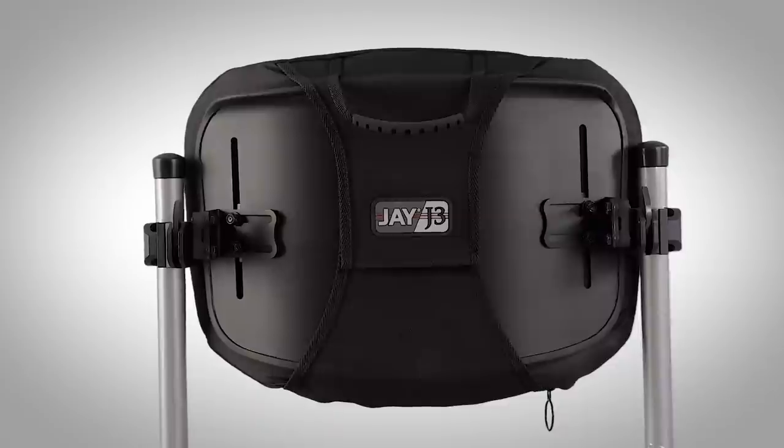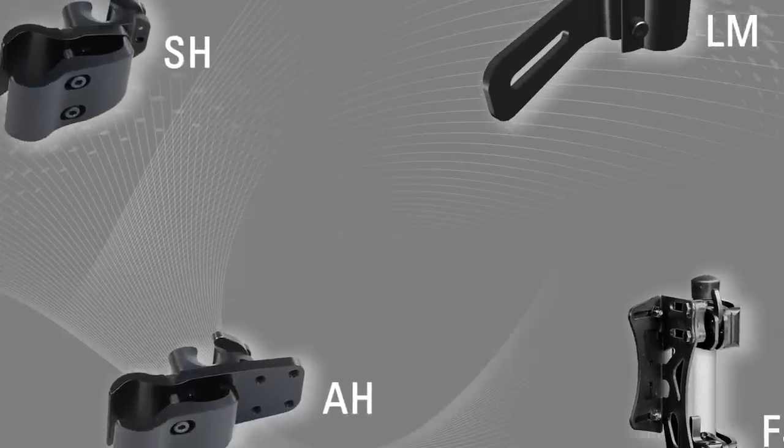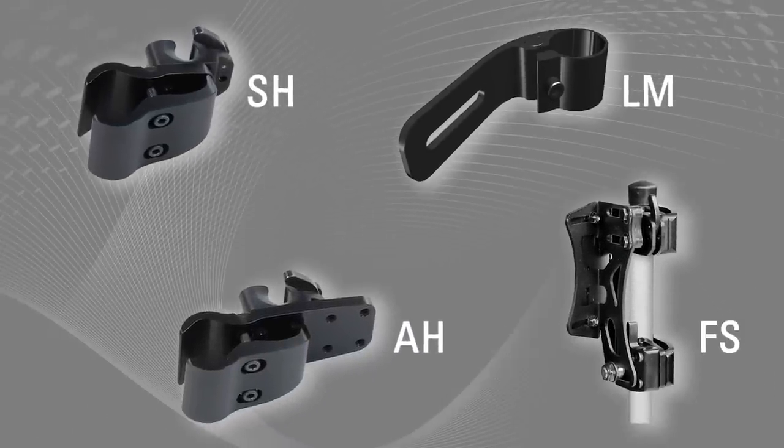Jay responded with the J3 Back, a comprehensive backrest system with over 150 different back shell configurations, but with such an extensive range came the need for an equally flexible set of hardware options.